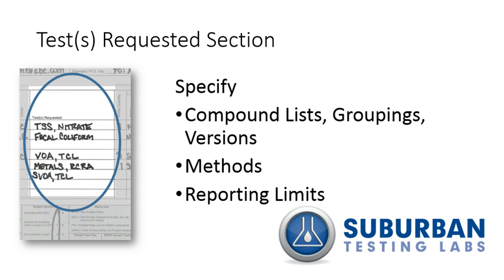Take something as simple as Total Coliform. If you write coliform on the Chain of Custody form, we have to ask ourselves: is that fecal coliform, Total Coliform Presence-Absence, or Total Coliform Enumeration? Running the wrong method has irreversible consequences because the entire sample is consumed during analysis. Also, holding times may vary.